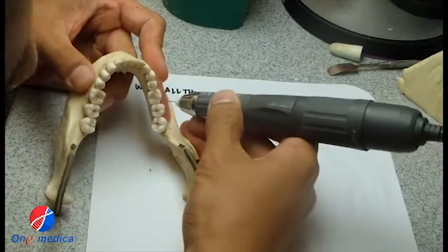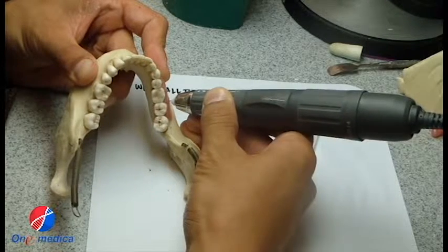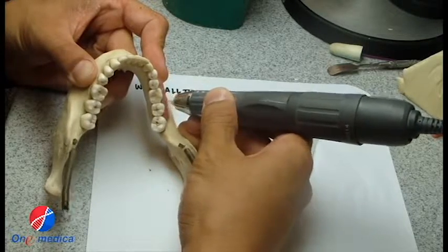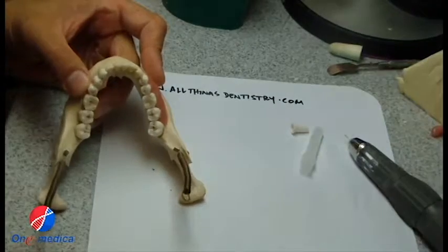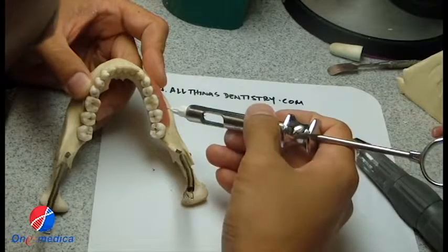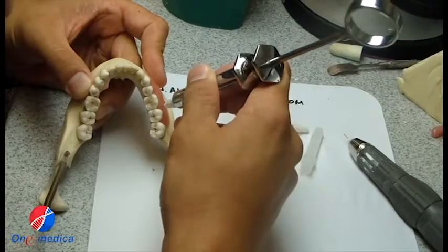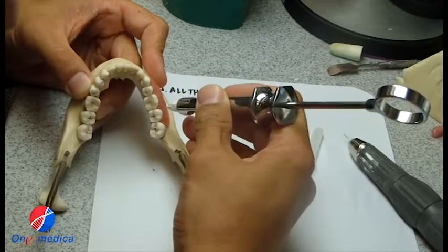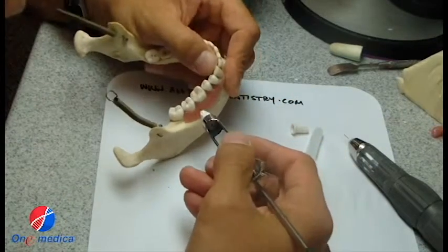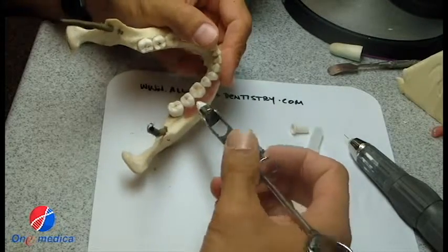Let me show you again. So I take the perforator, I'm going to go in slow, slow, slow, and then all of a sudden, boom, it just drops. And then you get a bit of hemorrhage. You have the patient anesthetized before this, I should have mentioned that. And then you take your trusty anesthetic syringe and try to find the hole that you made. Even though it's hemorrhaging, I've used this for years, and this has always been the most frustrating part of this technique, of this system.